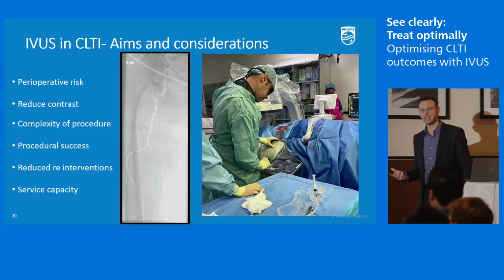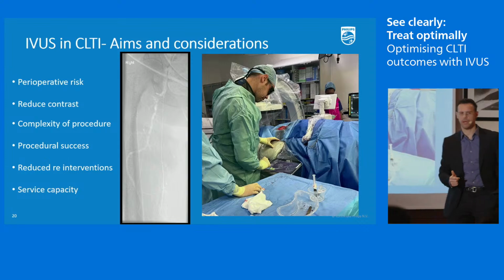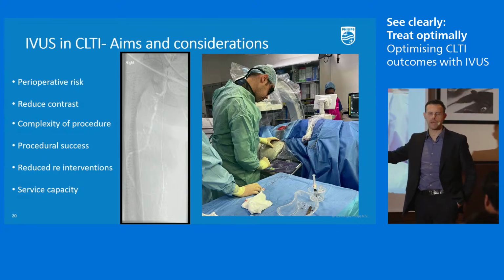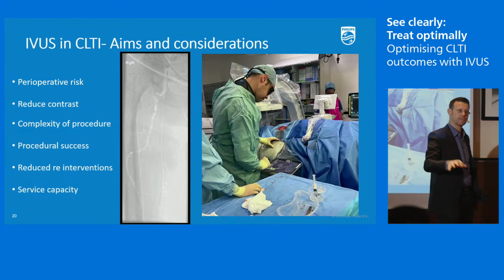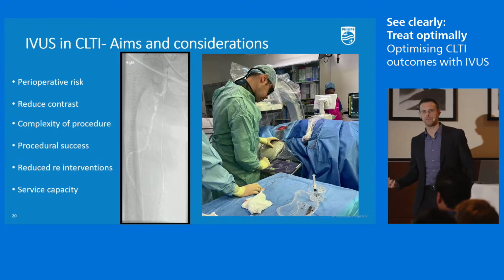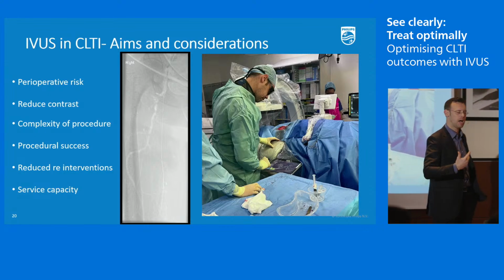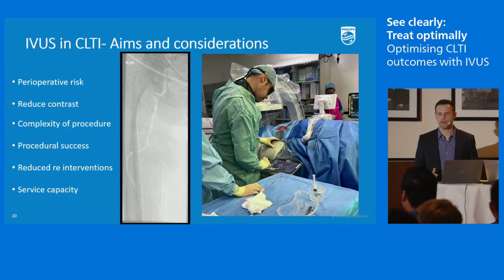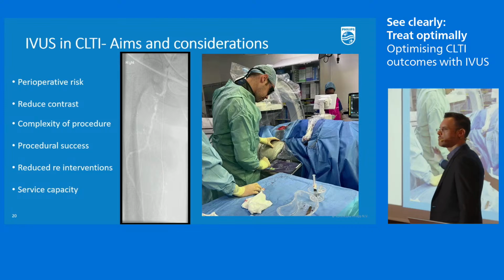I would also say that I don't know about the other parts of Europe or India, but where we are, it makes a lot more sense, with the number of people that we have to treat, to do 3 complex endovascular procedures on our hybrid operating list versus maybe 1 femdistal bypass. So in terms of patient flow, it makes sense for us to do a higher number of shorter procedures, hopefully with a similar outcome. In our operating room, we operate under a lot of restrictions.